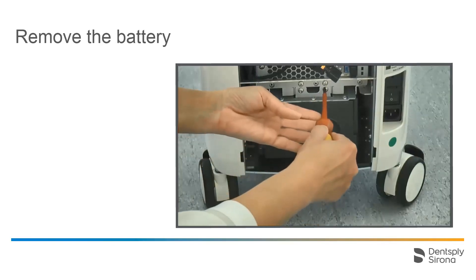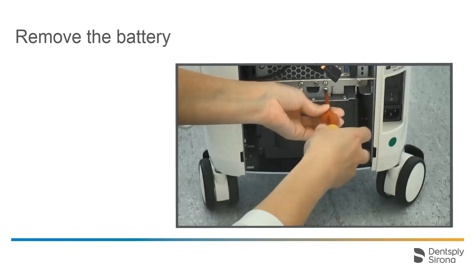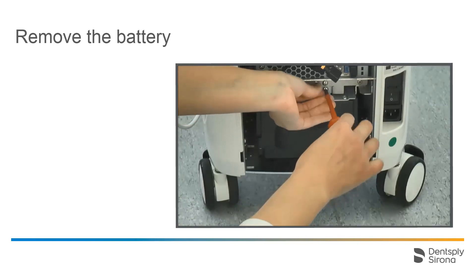Should it become necessary to change the battery, it can be removed just as easily. We release the two screws and pull the battery out.